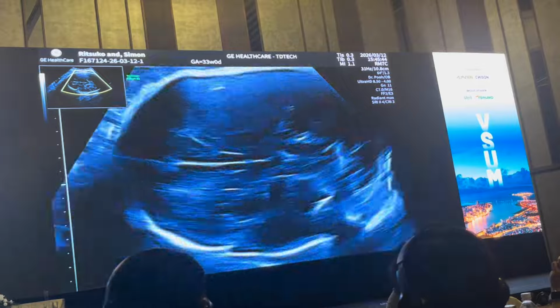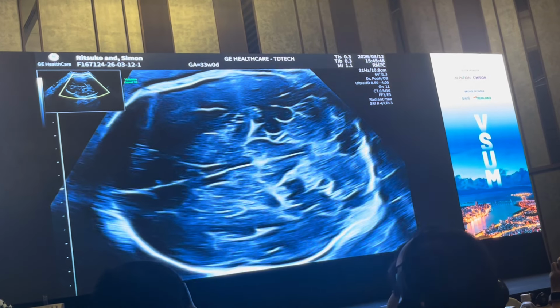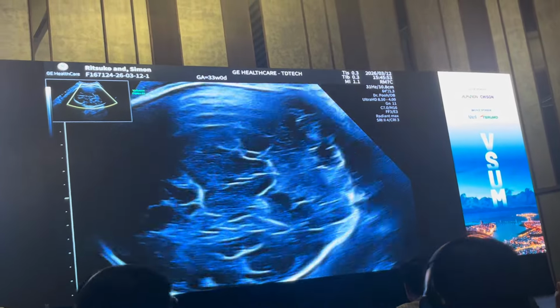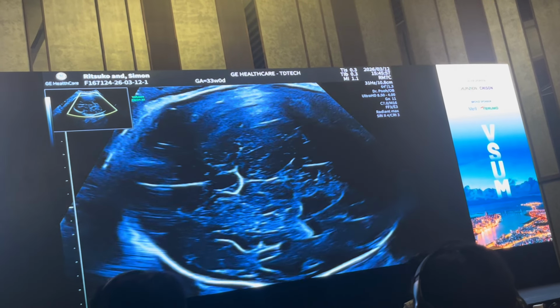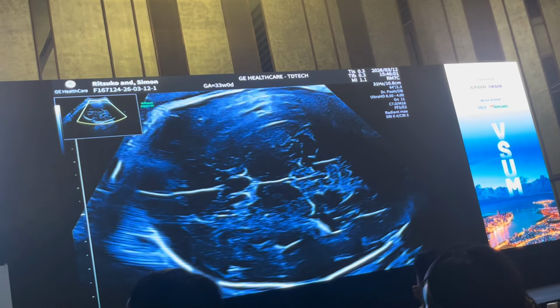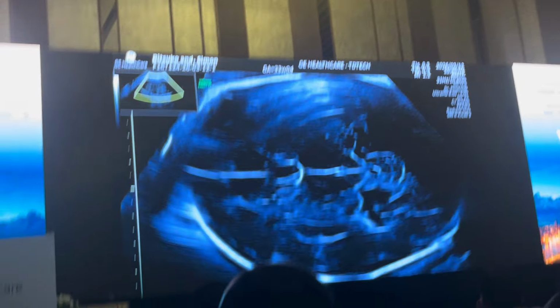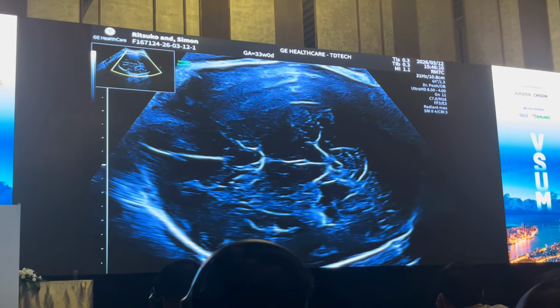What would you think? It's really difficult to determine the exact position to measure the CSP. Yep. Good point. So it just becomes difficult. And in terms of partial agenesis, is it more likely to be wider in partial agenesis than the AP diameter? Yeah. Good. Okay. Yeah, let's change the page.